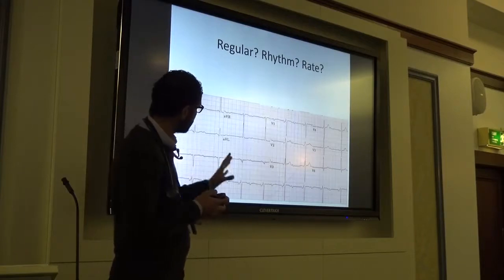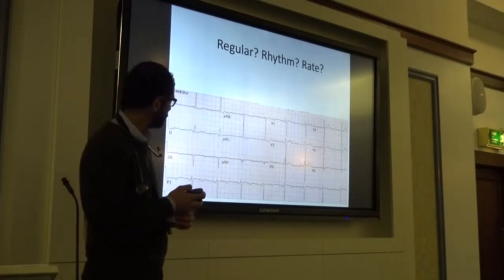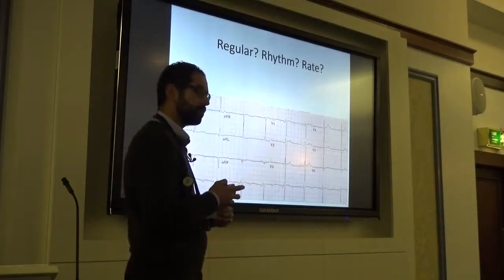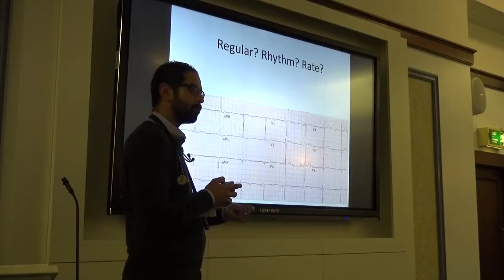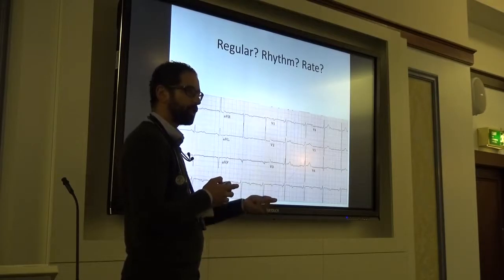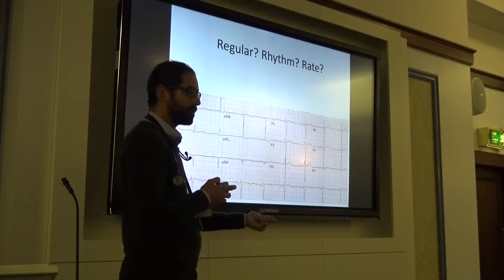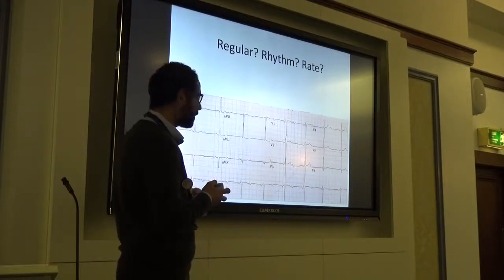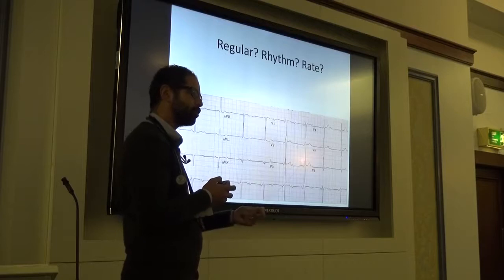So pick a lead where you can see things clearly. Sinus. Excellent, yeah. Sinus. So now you look for, because it's regular, usually it's going to be sinus, right? So if you're betting, you can say sinus and then start looking for clues. And then if it's regular, you said sinus, now let's look for the two conditions.